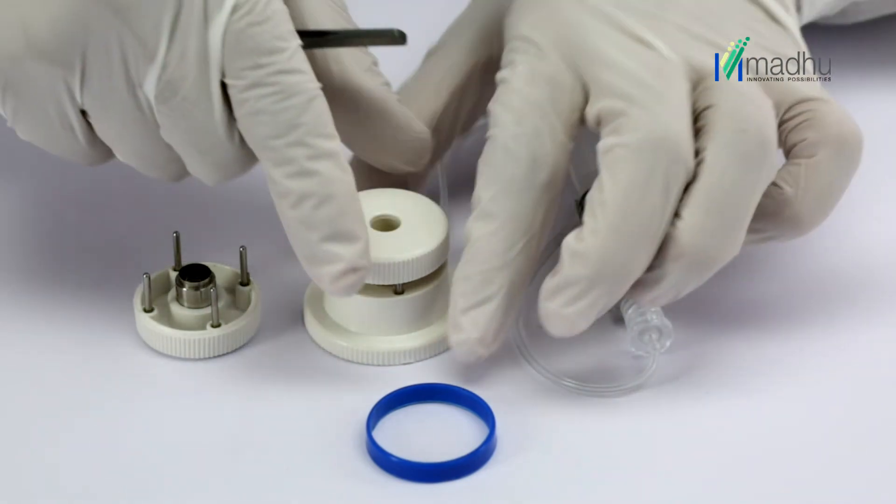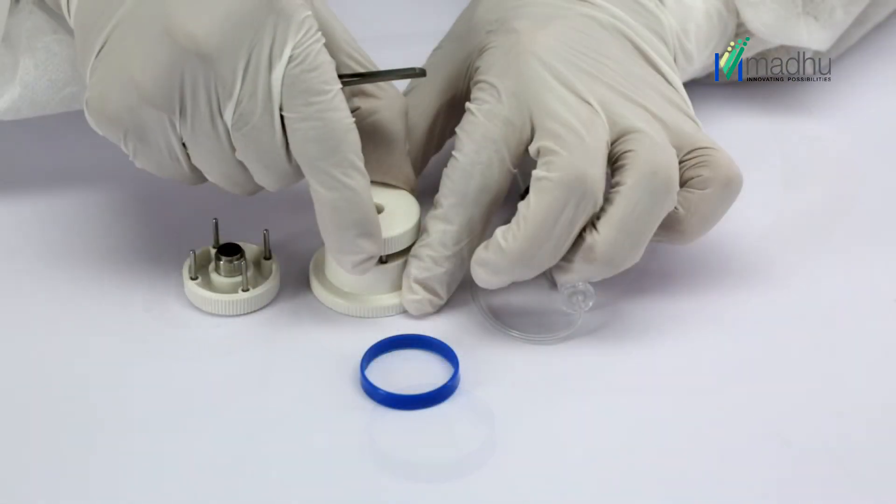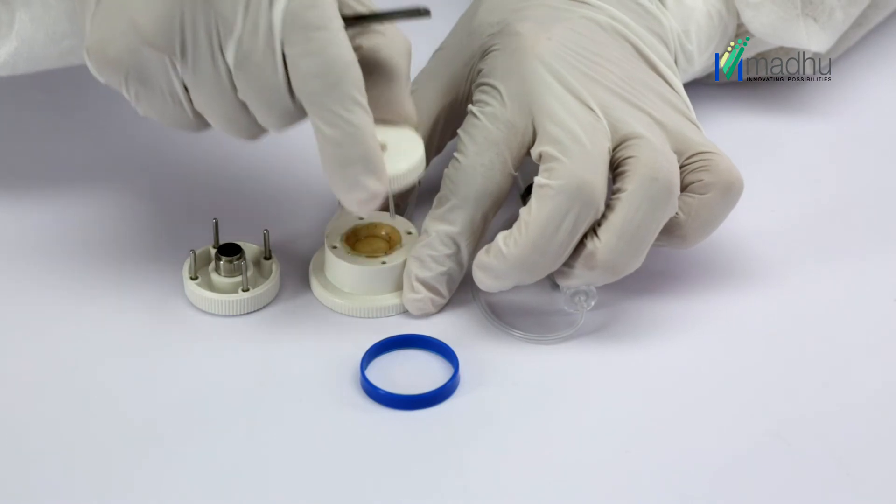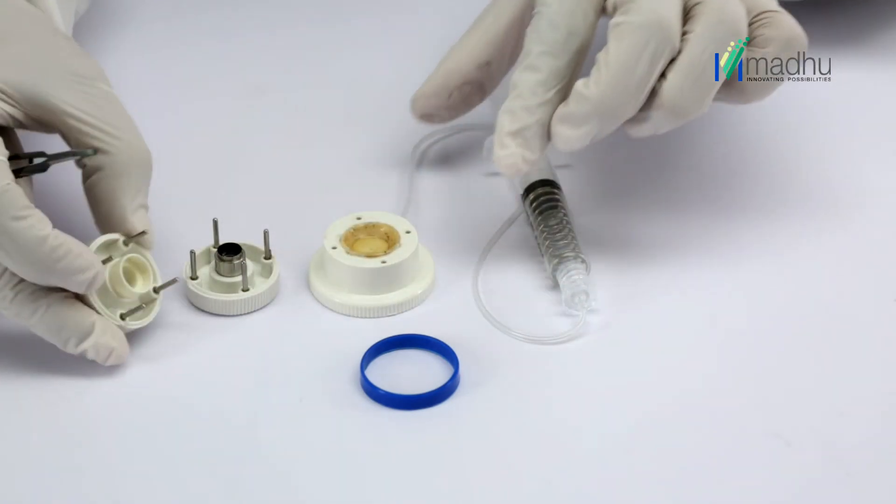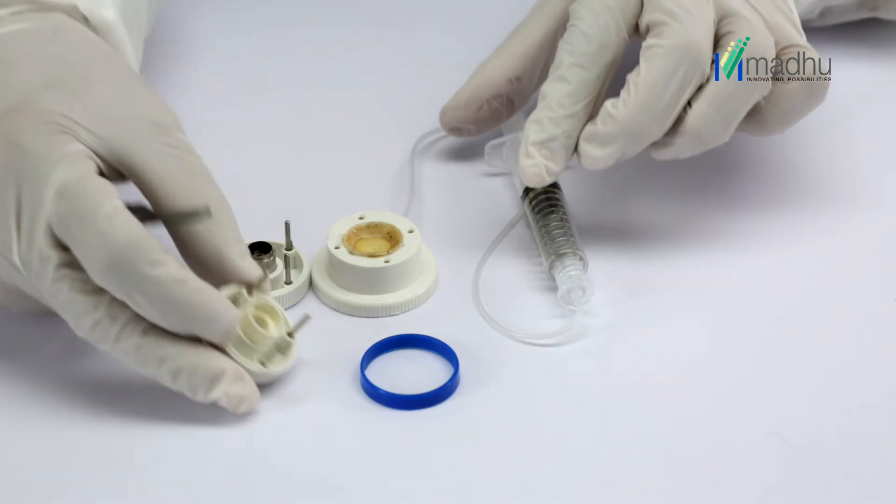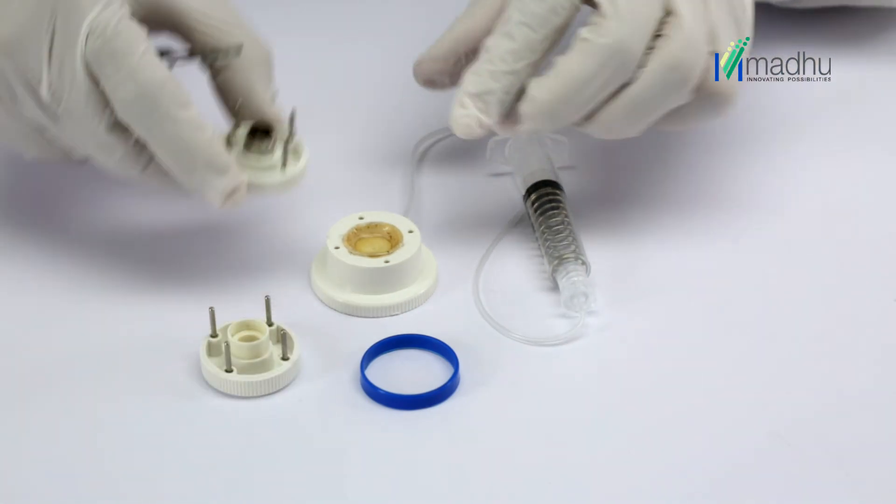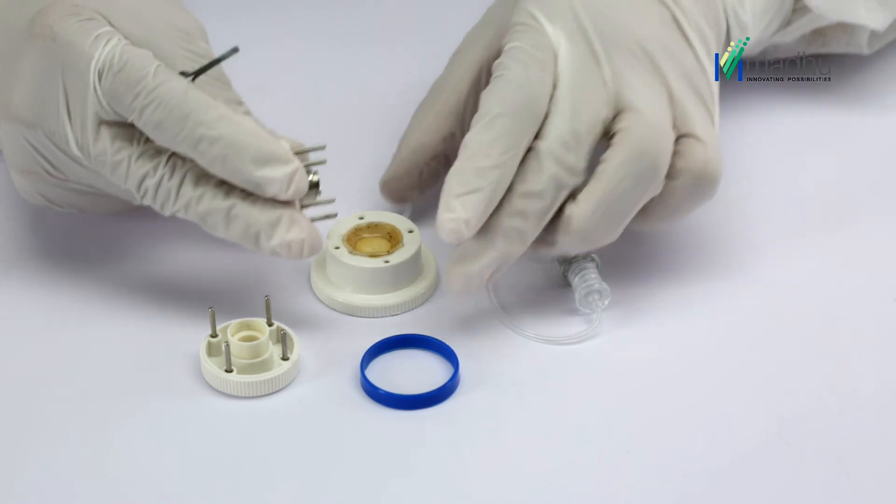While holding the cutting block base with one hand, pull the sitting ring housing upward with the other hand and discard. Now insert the four stainless steel guide pins of the trephine blade housing into corresponding holes in each corner of the cutting block base.